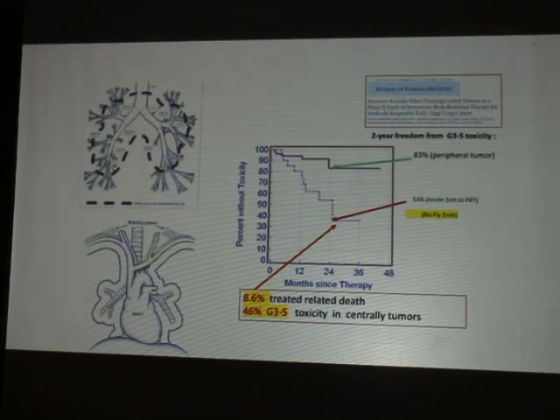So he told that peripheral tumors, or those away from the central structures, are very safe. But when you treat central tumors with radiosurgery, even doing the surgery is very difficult along the trachea and bronchus. So this gave rise to the concept of the no-fly zone. That means he advised it is a no-fly zone, don't try to experiment in the central zone.